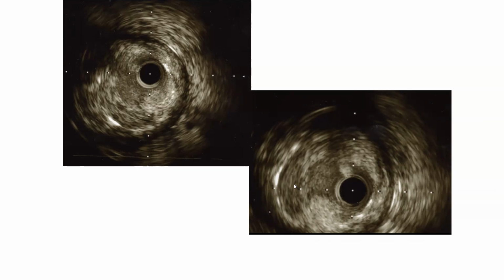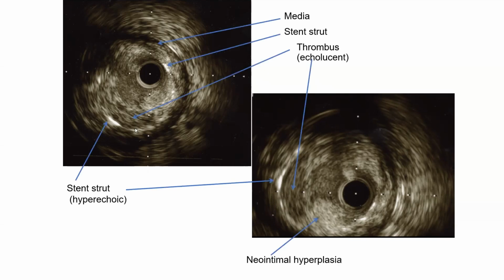This is actually in-stent thrombosis. So this patient has a combined mechanism of severe in-stent tissue growth, more than 50% of the stent, but also in-stent thrombus formation. So this patient, we treated him with balloon angioplasty, but we had to put another stent because of the in-stent tissue growth that may have been contributing to the thrombus formation. So it's a mixture of thrombosis and significant tissue growth.